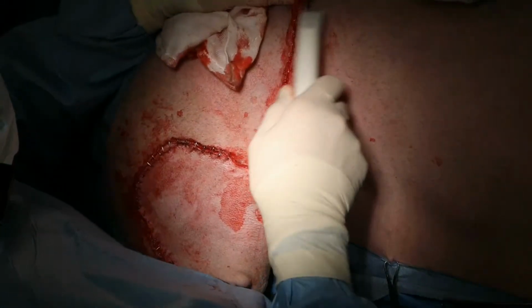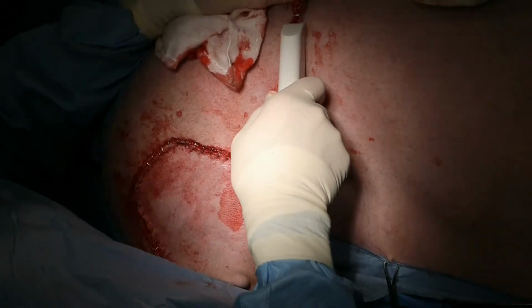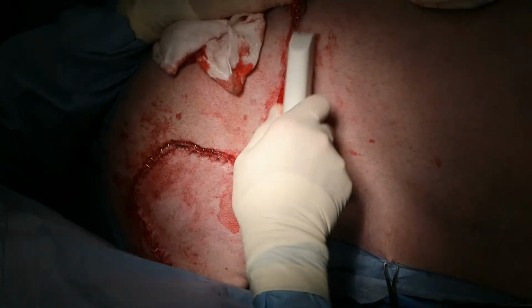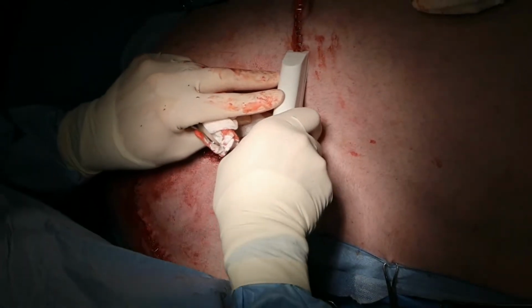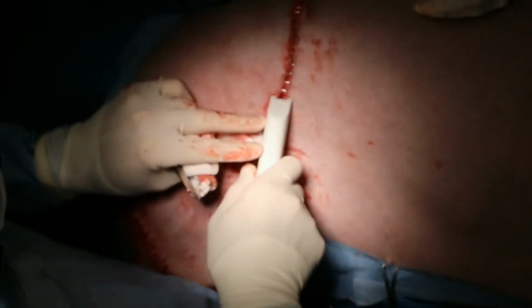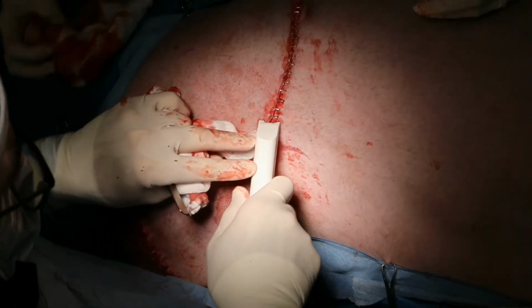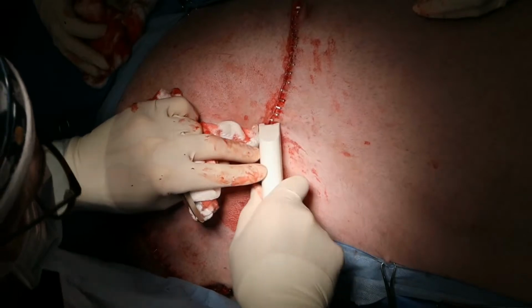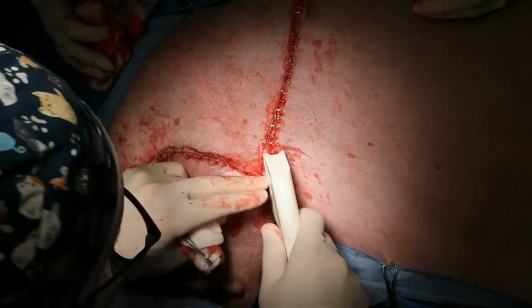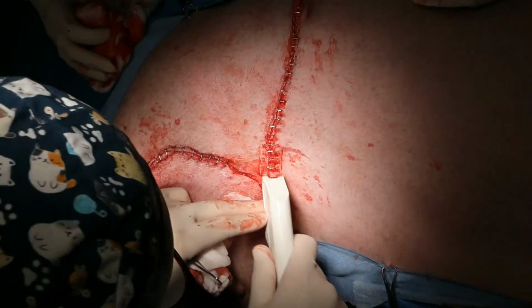There's a question as to whether the local will already have worn off by the time the dog wakes up. We're using Marcaine, which lasts 4 to 6 hours, so it should last well into the afternoon. We have done an epidural as well, and then we will provide methadone as a supplemental analgesia.